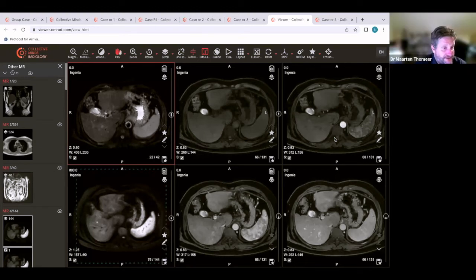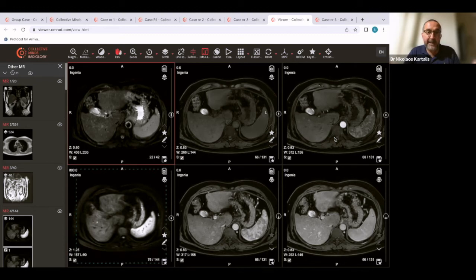I agree, yes. But the idea is that if you have already done it, because the patient has colorectal cancer, and you find some lesions that are unclear, is this hemangioma or metastasis, and in particular in patients with pancreatic cancer, this may play a huge role. Give it a chance. Look on T2, look on diffusion and the dynamics.